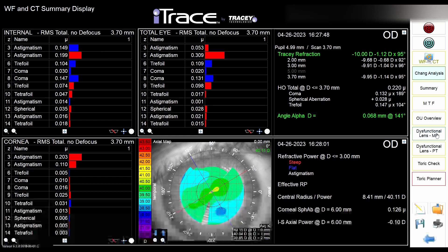After the examination, this is the wavefront and corneal topography summary display — the most important display this machine offers. Here you have all the information, including refraction based on zones, angle alpha, and higher-order aberrations. You also have the axial map and aberrations broken down as total, internal — meaning probably the lens — or corneal.